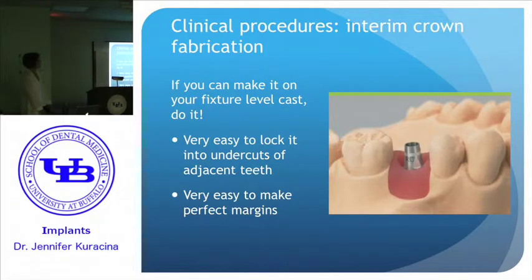The solid abutment absolutely has to stay in the mouth, as I said, and therefore you need to make an interim restoration for it. I always encourage students to try to do it on a cast. Now, if you're doing it for a solid abutment, you're probably going to have to make a shell that will be relined in the mouth, because again, you're not going to have the thread timing correct if you just screw the abutment onto the cast, or you may not have it correct.